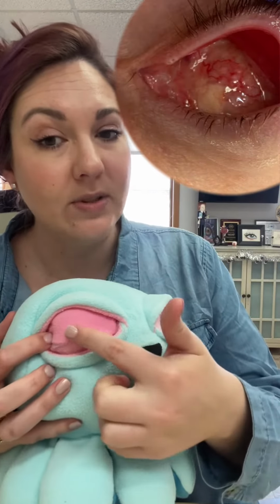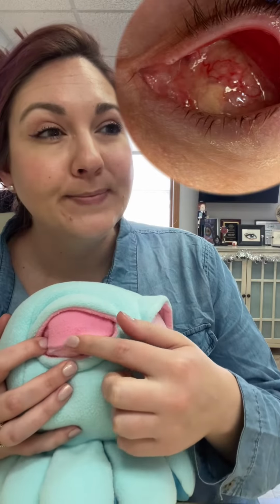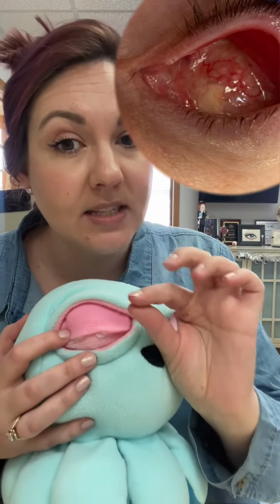A hotspot is an area of redness, here's a couple of examples, that are an issue or concern that the tissue is starting to thin between the prosthesis and the implant.